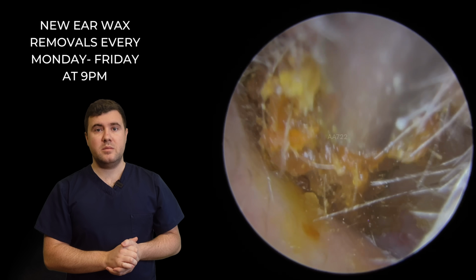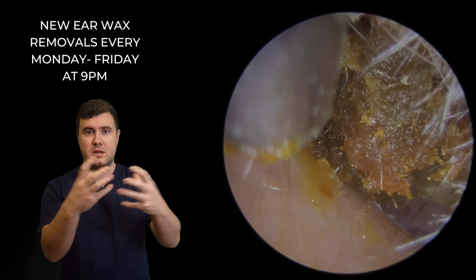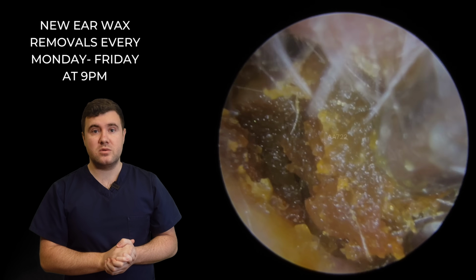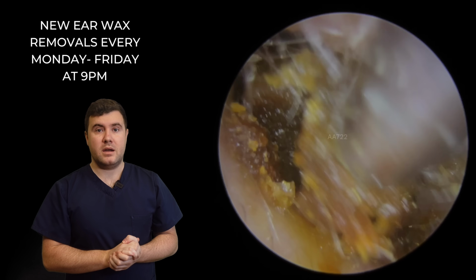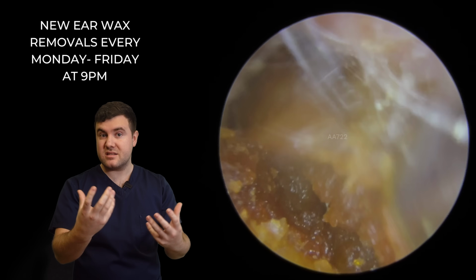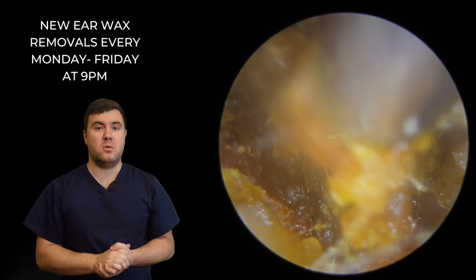So we got a little bit of a wiggle going on here. A lot of hair as well matted in amongst all this skin and wax, which is quite common actually. We do see this quite a lot. This will just be more from where the patient has been having haircuts and the hair has just kind of fallen inside the ear and just got stuck in amongst the wax.